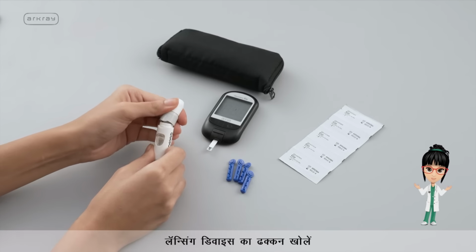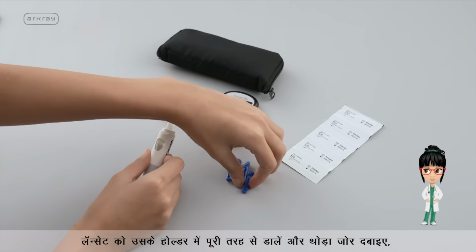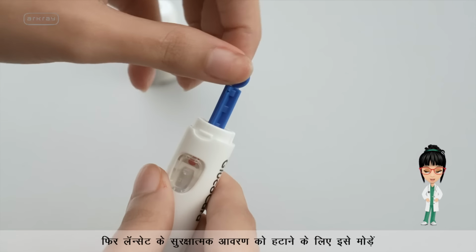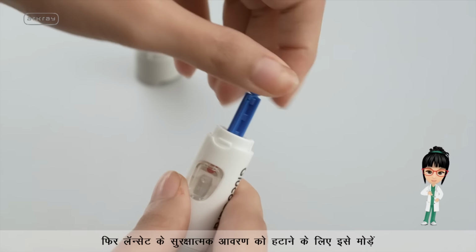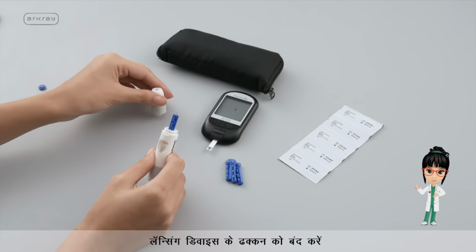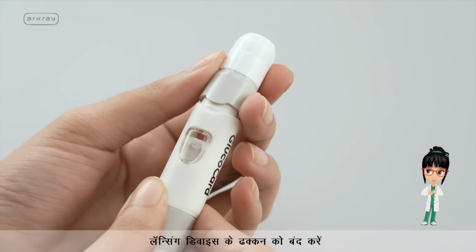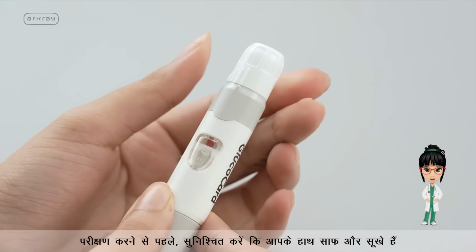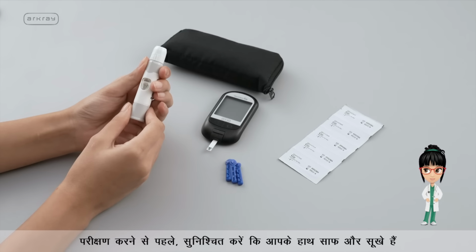Open the lid of the lancing device, insert the lancet into its holder fully and push hard. Then, twist it to remove the lancet's protective cover. Put back the lid of the lancing device to close it. Before performing the test, ensure your hands are clean and dry.